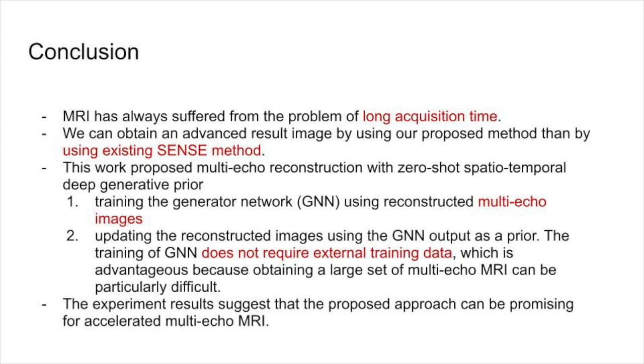The training of GNN does not require external training data, which is advantageous because obtaining a large set of multi-echo MRI can be particularly difficult. The experiment results suggest that the proposed approach can be promising for accelerated multi-echo MRI.